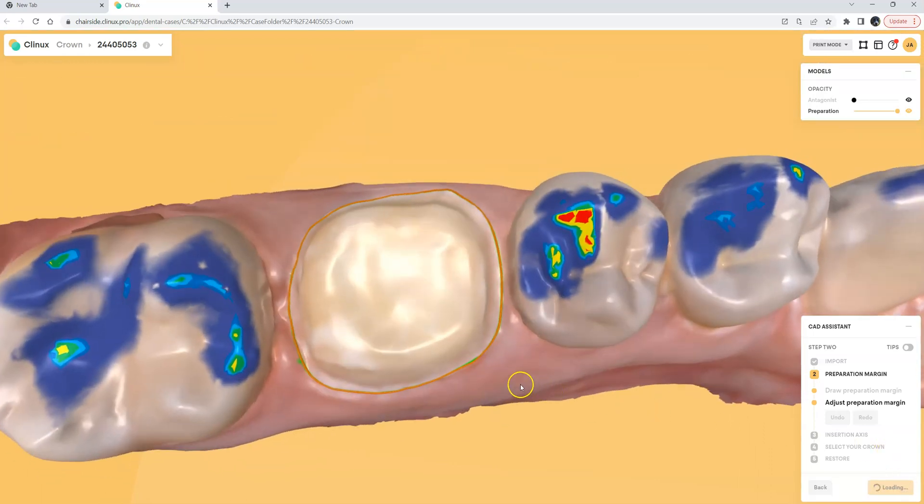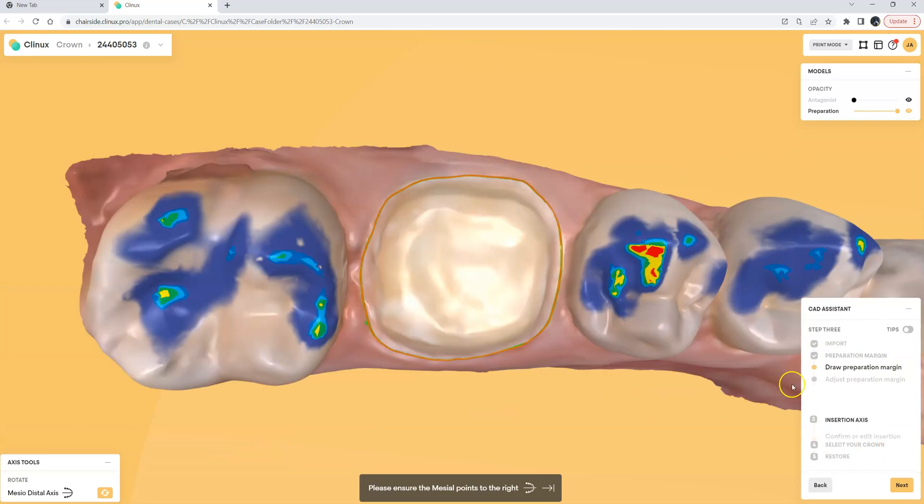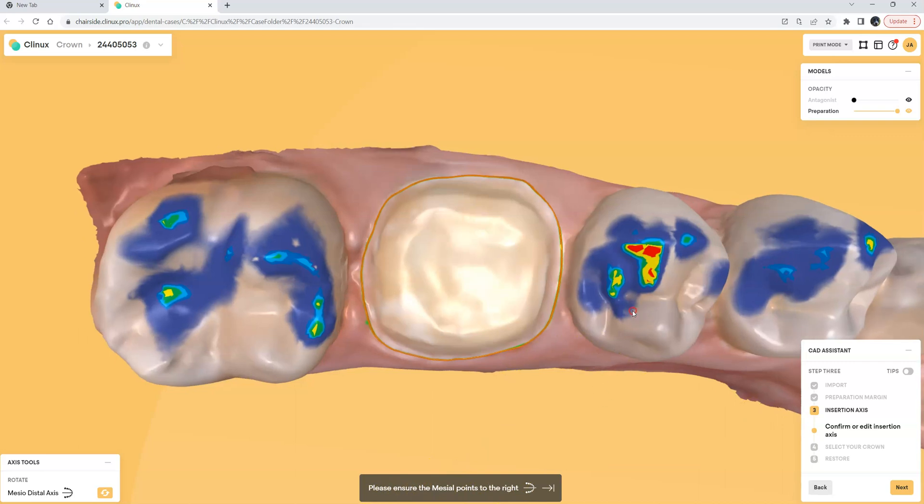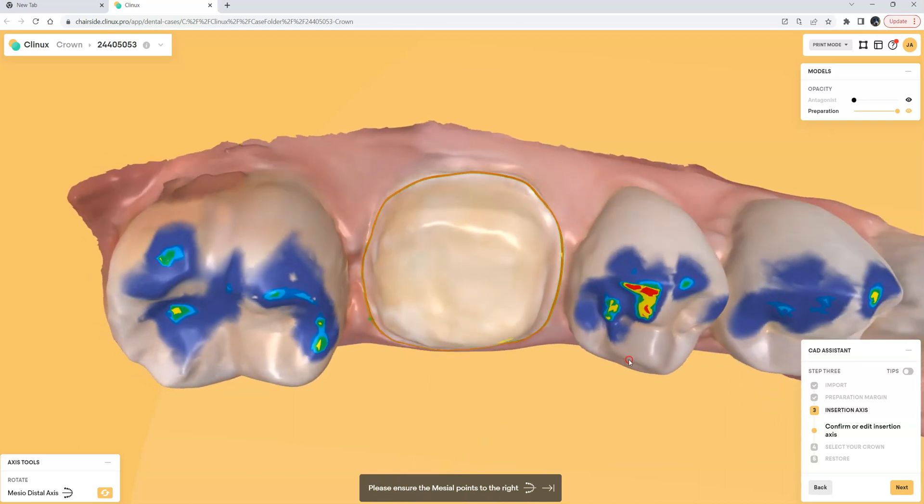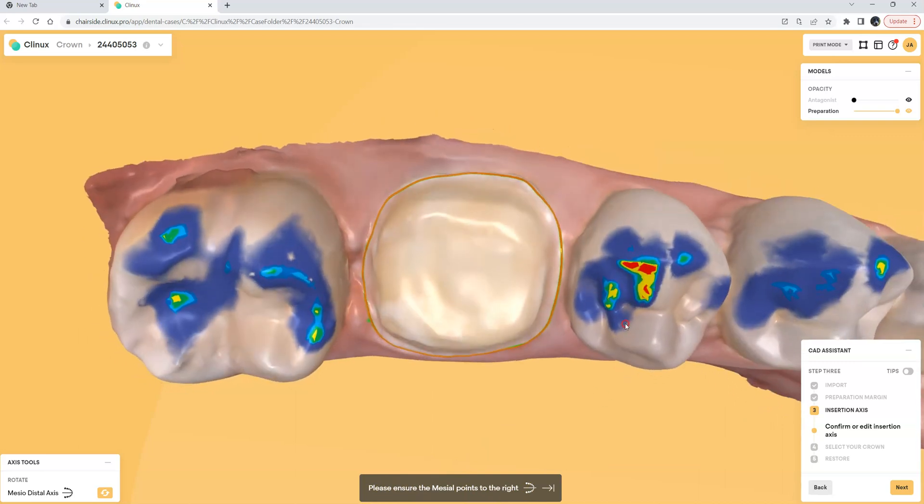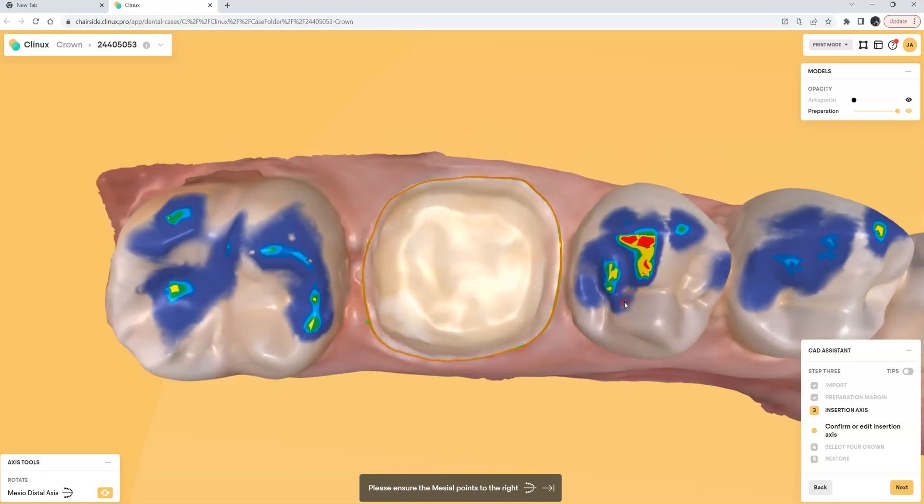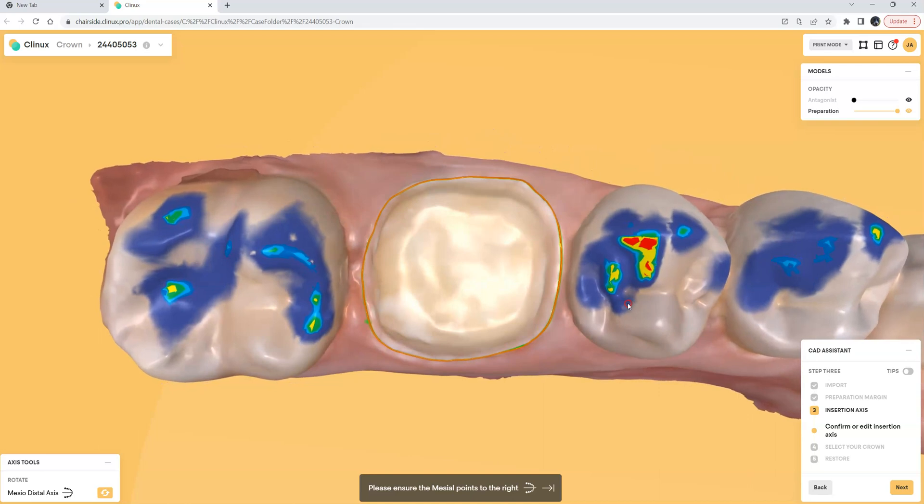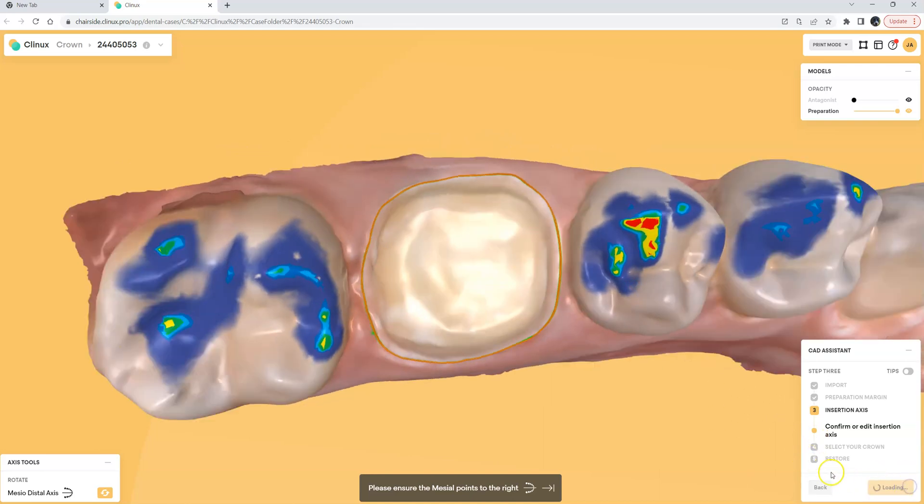Let's go ahead and click the next button and go on to the next step which is the insertion axis. It'll tell us to please ensure the mesial points to the right and of course we can look for any undercuts which will be highlighted in yellow. We just want to define a nice clear path of draw for this crown and set the model axis like that. Let's go ahead and click Next.